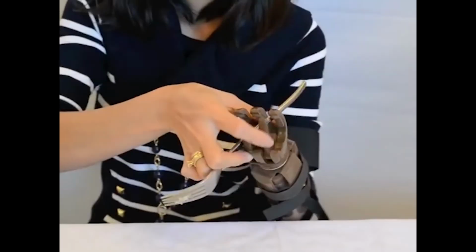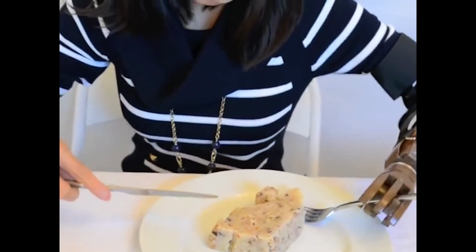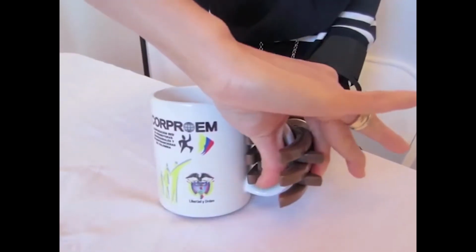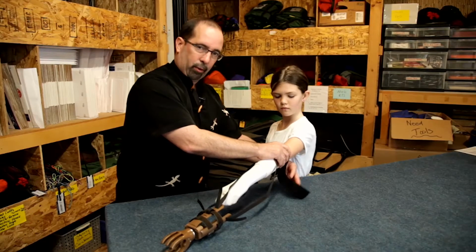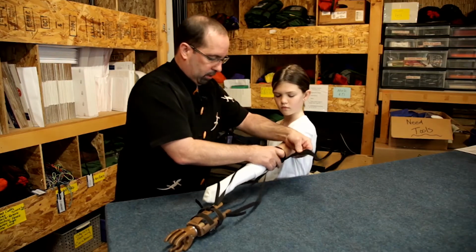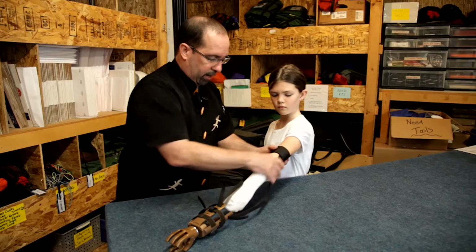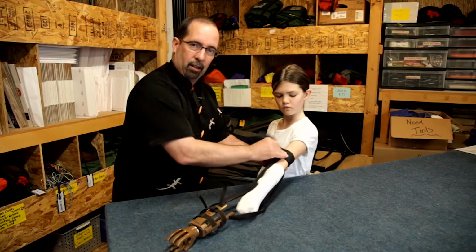We had a session where we said, how do we make some of these hands in the very beginning? And we made a dozen prototypes. My wife and I took them to Vietnam in 2005. I cannot say that we had success. In fact, maybe I would even say it borderlined on failure. The reason that we had problems was the hand was not the right color. The hand didn't work properly. It didn't have adequate springs. And also it was very difficult to strap it onto the person's arm.